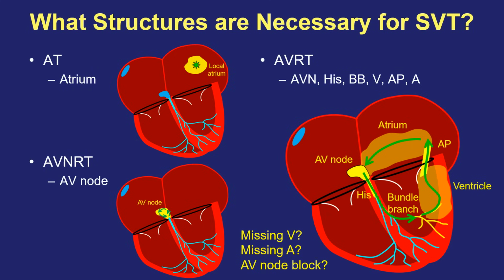So it's important to think of what structures are essential so that when you make observations that a structure is shown to either not be required that has implications, or a structure absolutely must be required that also has implications. And let's review some examples.